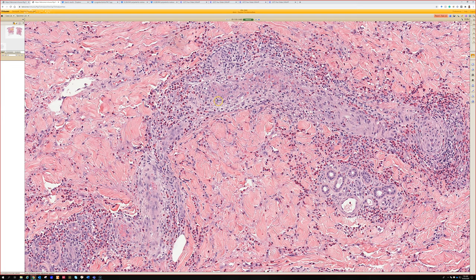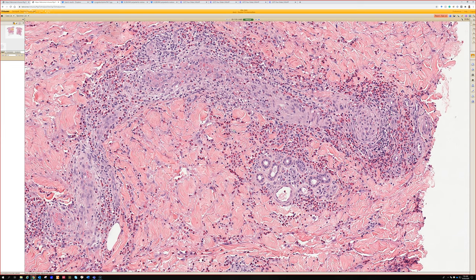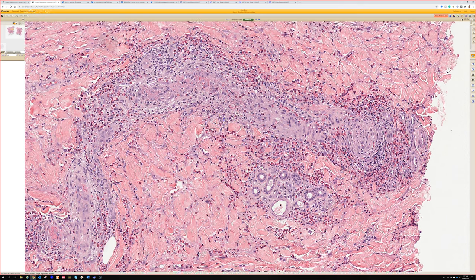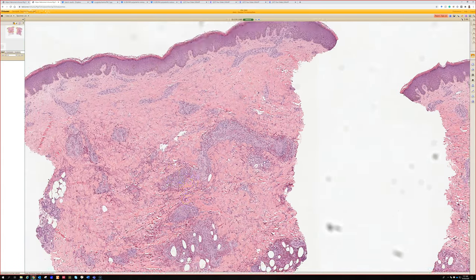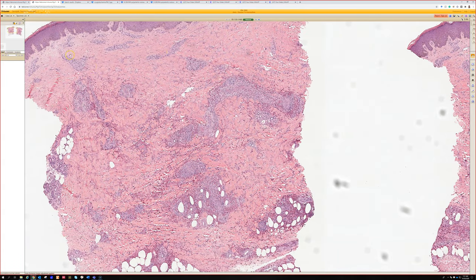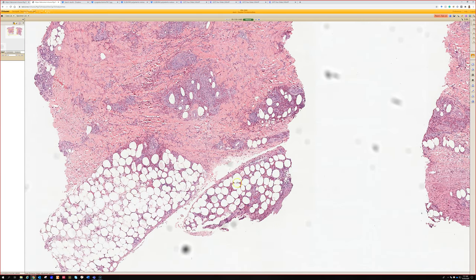These are still relatively small vessels. They look bigger, they're kind of expanded, but most of the vessels are in the dermis. Most of the dermal vessels are on the smaller side. The thing from low power is this is superficial and deep — the vessels in the superficial, mid, and deep dermis are all involved. It seems to be going down even to the subcutis.